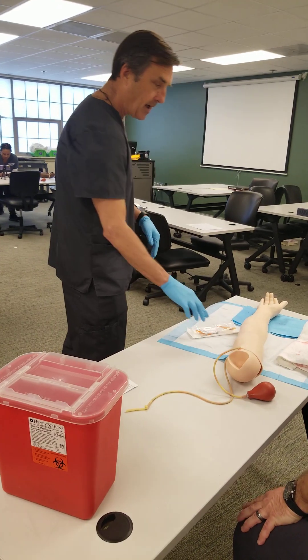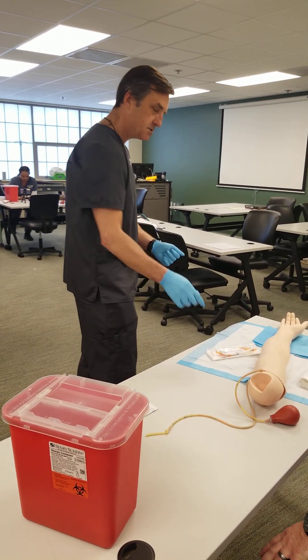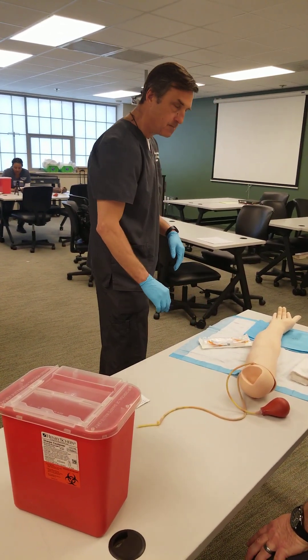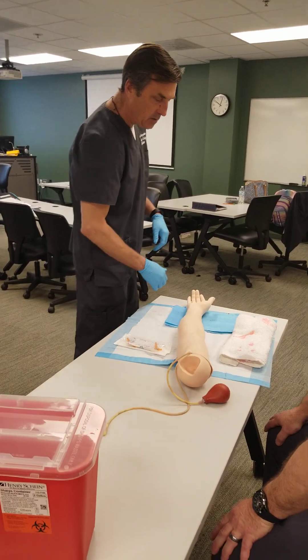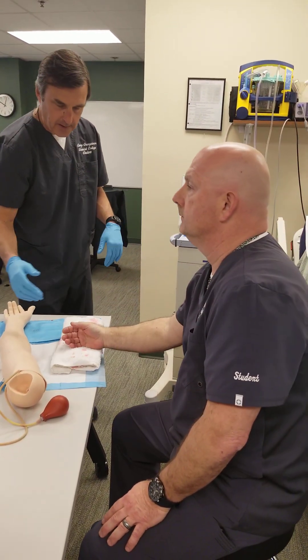Have you ever had an ABG before? Well, we're sticking a needle in an artery, so there might be a little bit of pain, but we'll make it as painless as possible. Before I do that, I'm going to perform a modified Allen's test.